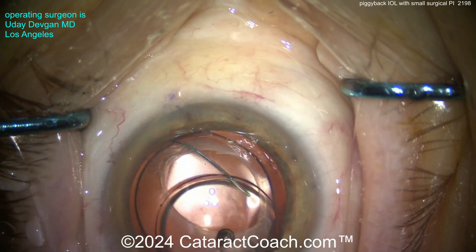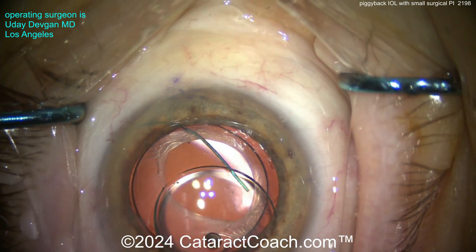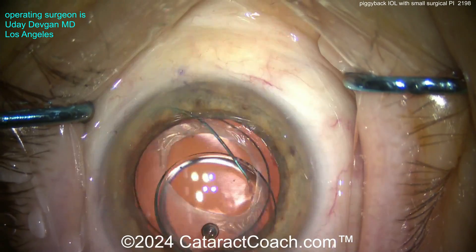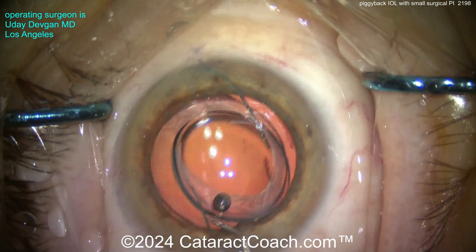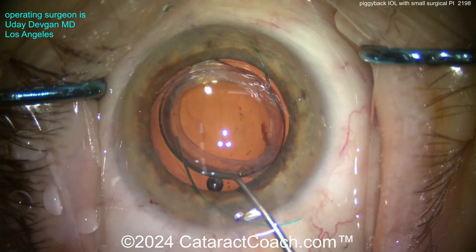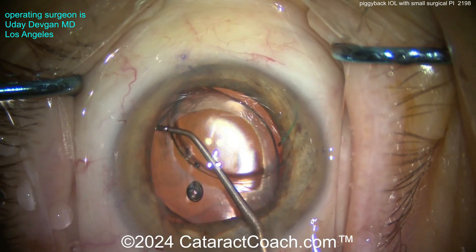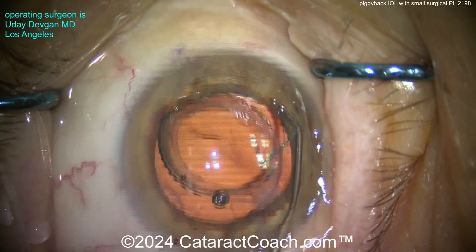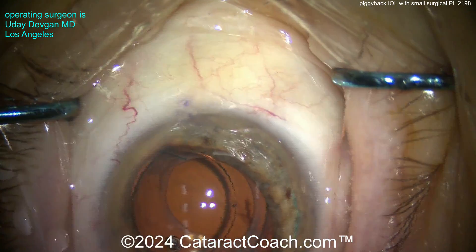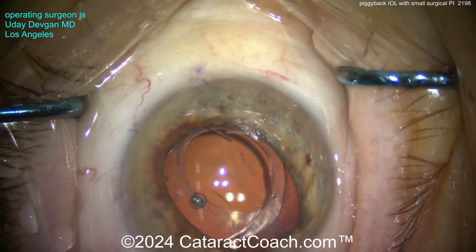We're putting in a three-piece silicone lens. In the bag is a single-piece acrylic toric monofocal lens, and here in the sulcus we're placing a three-piece silicone IOL. This silicone IOL has a six-millimeter optic. We're going to place it entirely in the sulcus. You can see the angulation between the haptic and the optic is about five to ten degrees — that helps keep the optic pushed backwards and also keeps it away from the posterior surface of the iris.